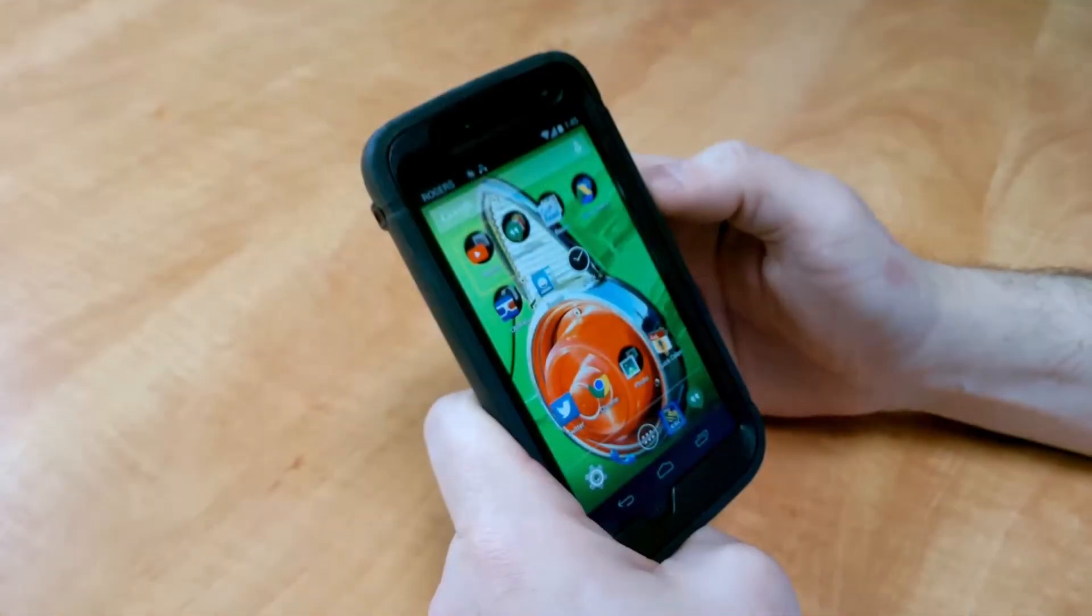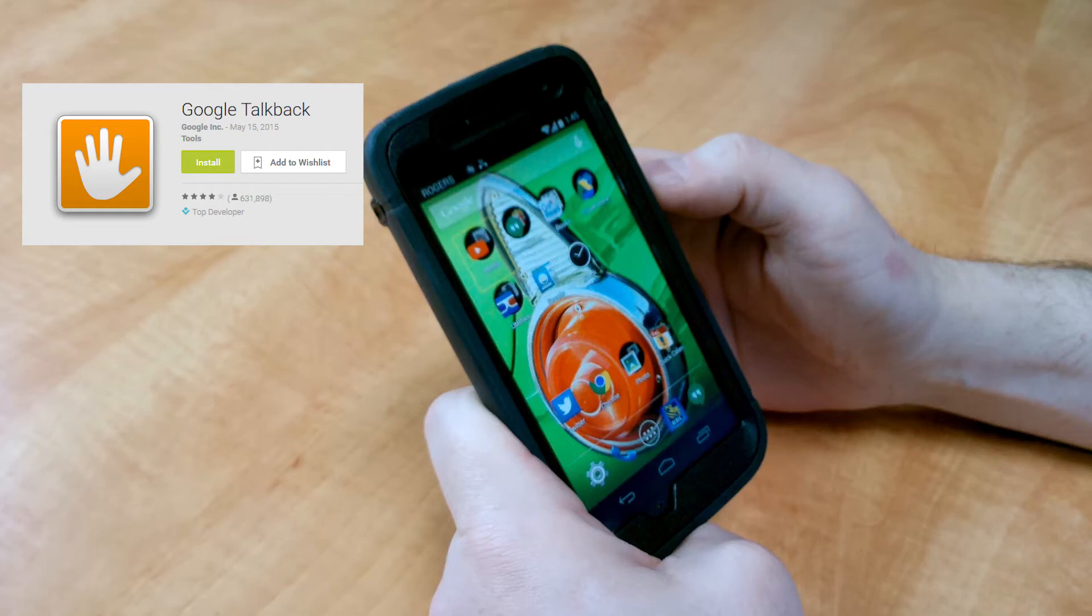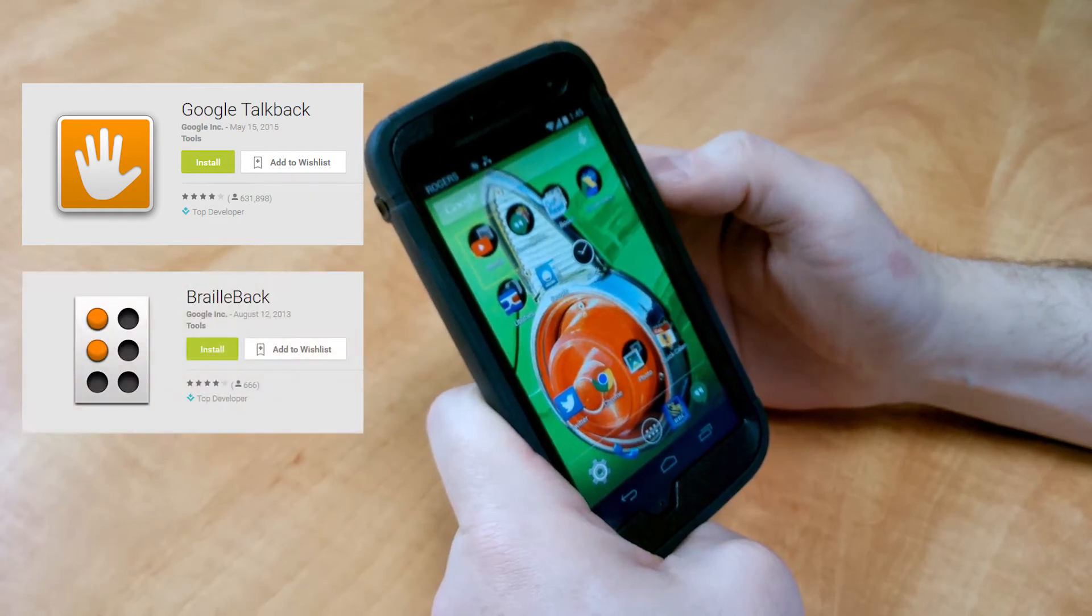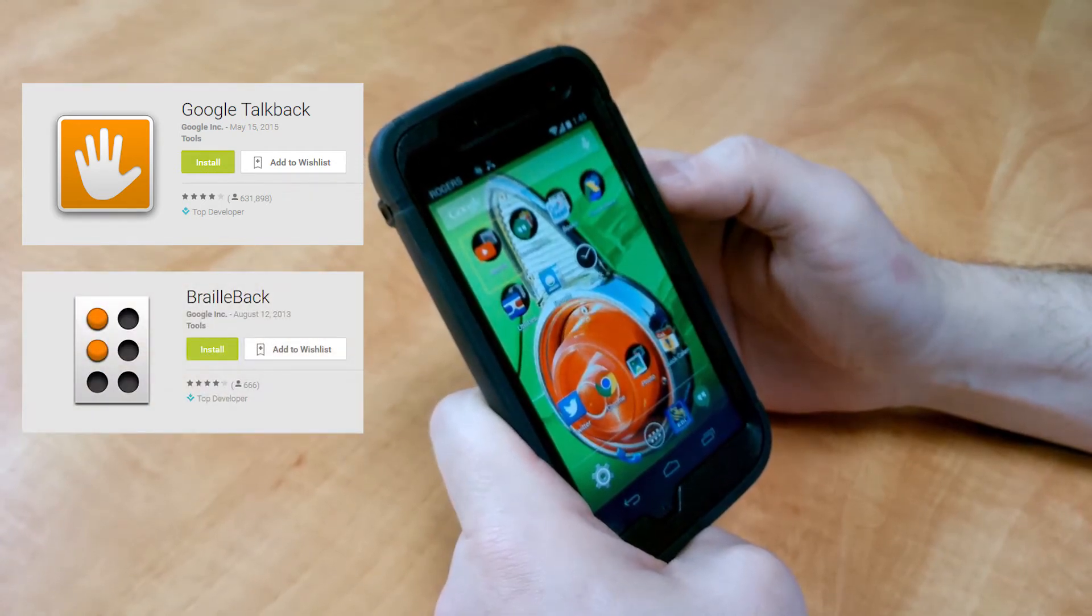So the first thing you'll want to do is make sure that you have both the free TalkBack and BrailleBack apps from the Google Play Store installed on your device.